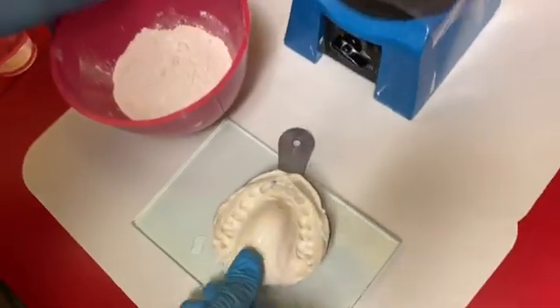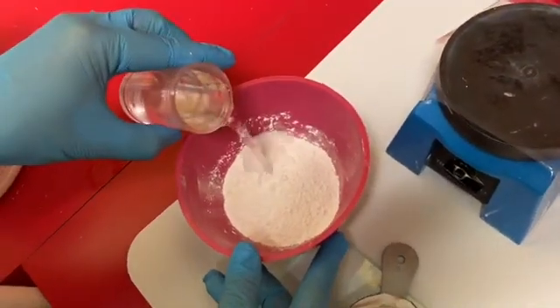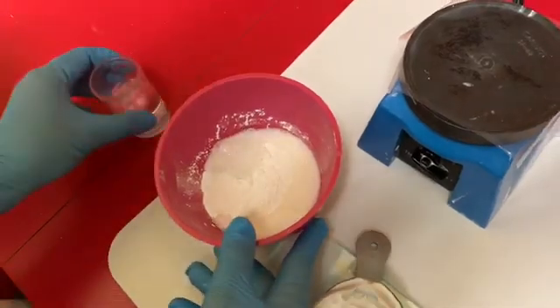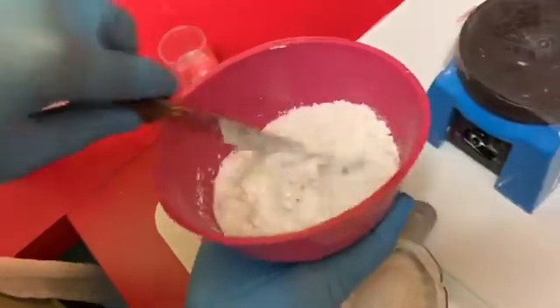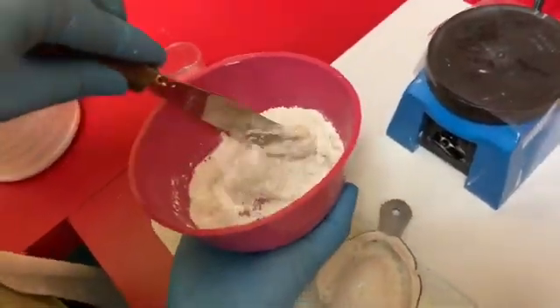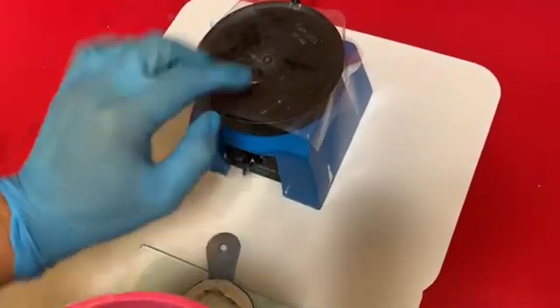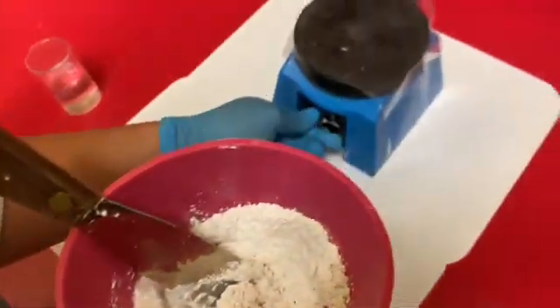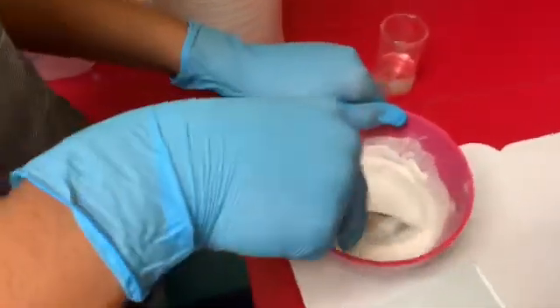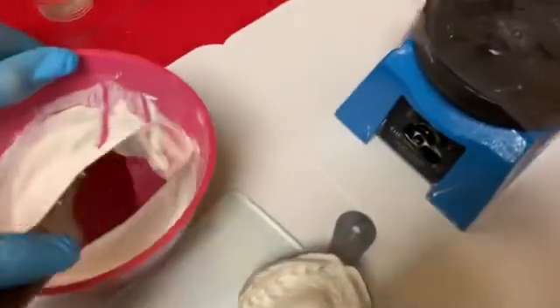Now we're going to pour it up in our stone. We have water, a spoon, and powder — let's mix it a little bit here. I'm going to let Nicholas have a chance to start mixing it up and see how this works, and then after we get a good mix we're going to put it on our vibrator. Nicholas is mixing up the stone for the first time ever — let's get it nice and creamy. Now let's turn on our vibrator.